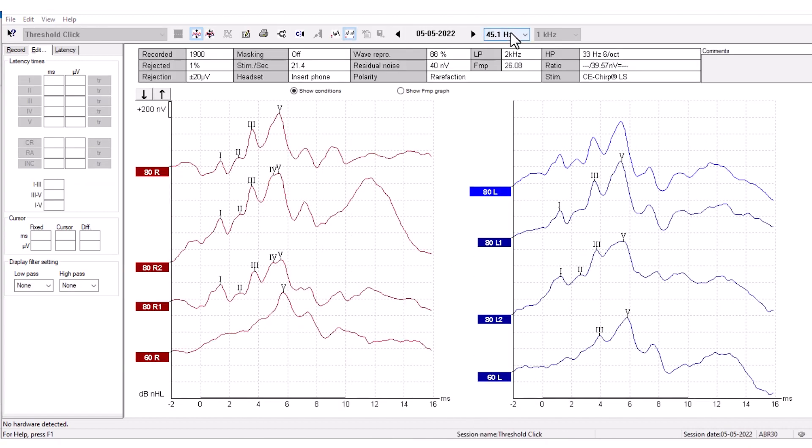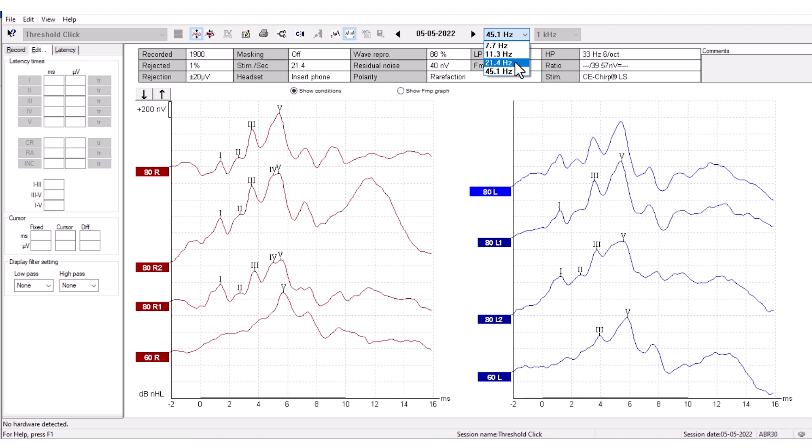Next to the Session function, you can change the Stimulus Rate. This gives the option to change the Stimulus Rate to a few predefined settings.